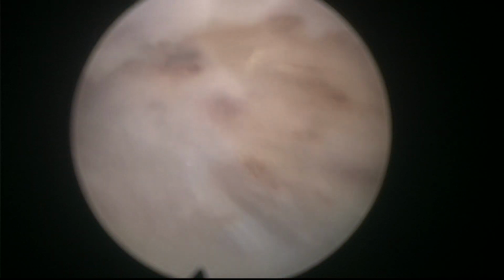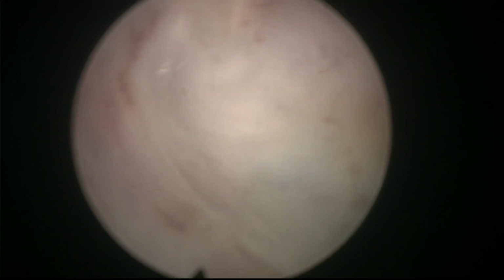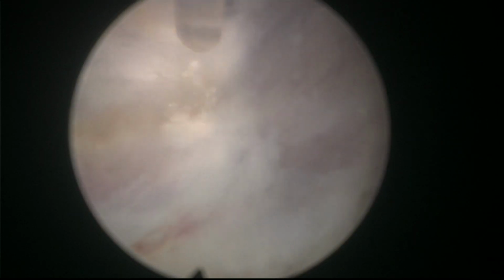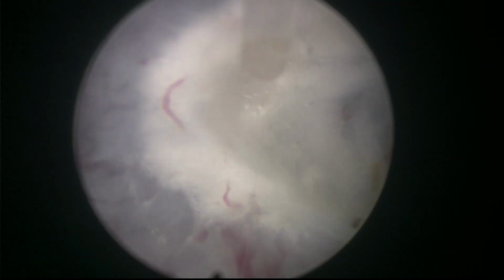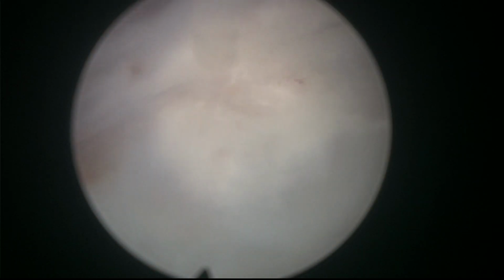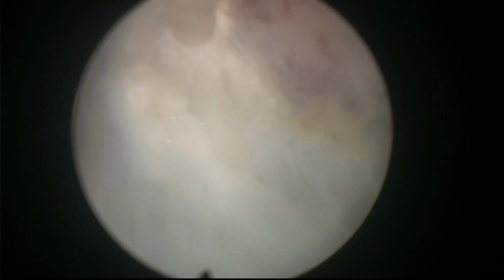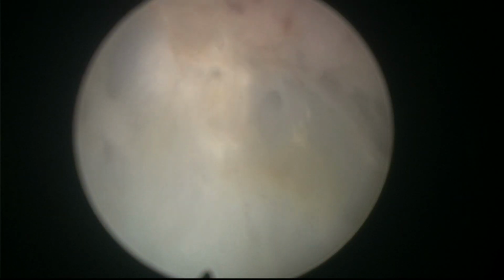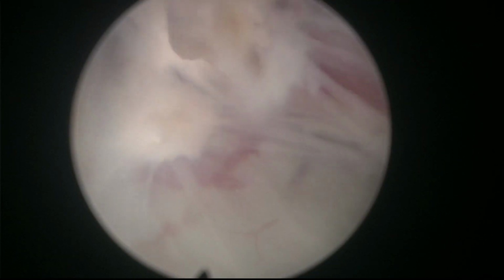But let's see, we have to understand the anatomy and understand that we are looking at a much magnified image of the plane. Things that look very big on the screen are relatively small. The fiber is 0.5 millimeters, so it's very, very small. Whatever we are seeing is rather small. I think all the adenomatous tissue should be taken out, but without justifying leaving tissue behind. What I'm trying to say is that you have to distinguish what is important and what is not important at all.